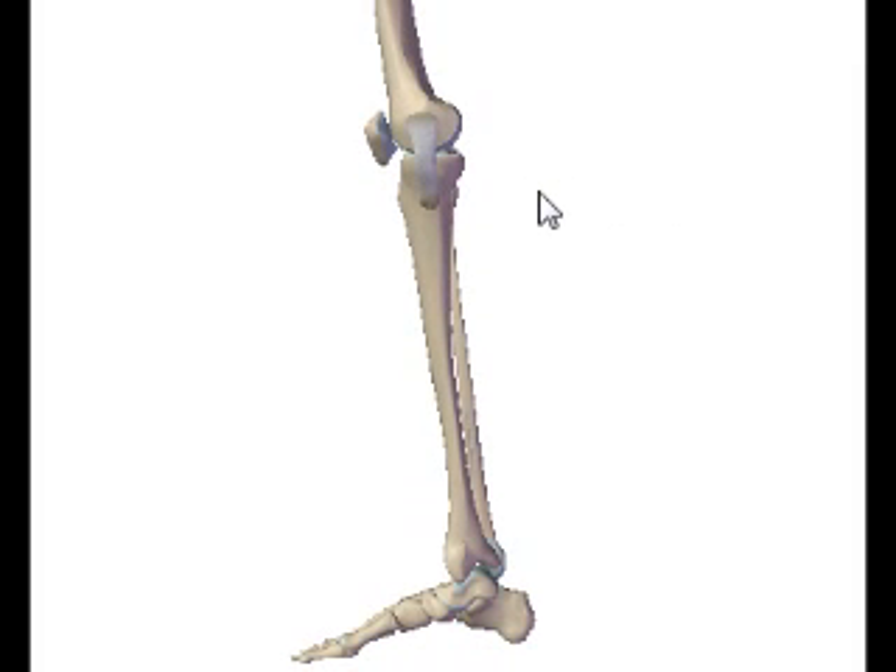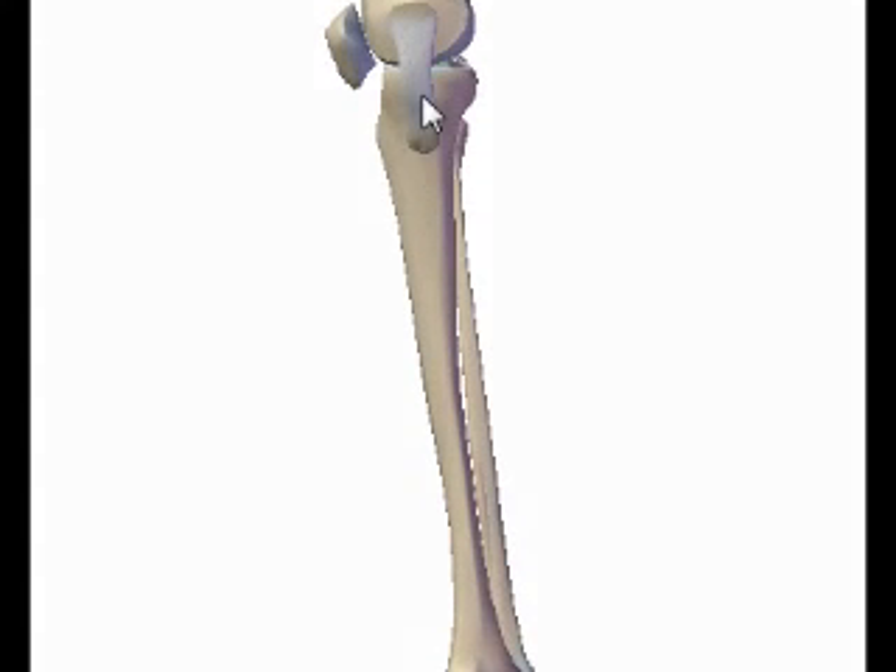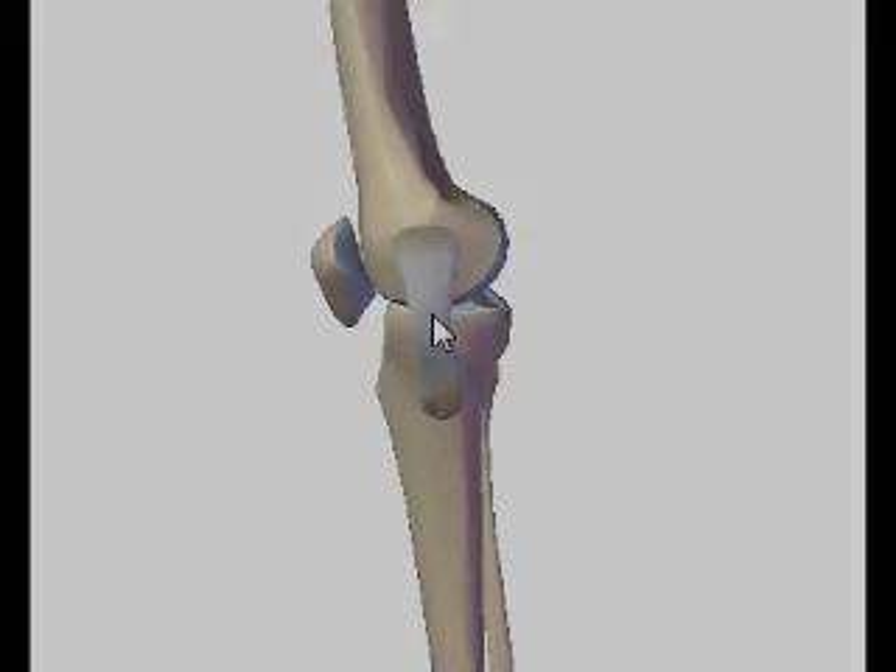Feel the patella. You can actually have the patient, before you take the picture while you're positioning, bear weight on the opposite leg. That'll actually loosen up the patellar tendon so you can feel the patella a little bit better. Then when you're ready to take your picture, go ahead and have them lift that unaffected leg out of the way, and you should get yourself a nice weight-bearing lateral knee.